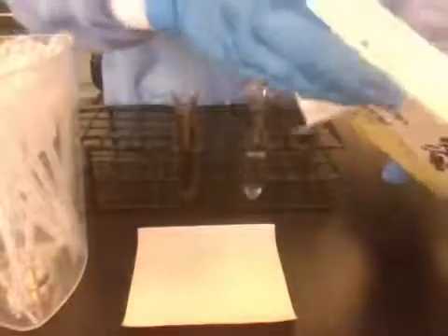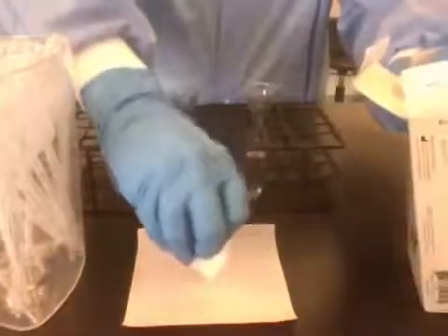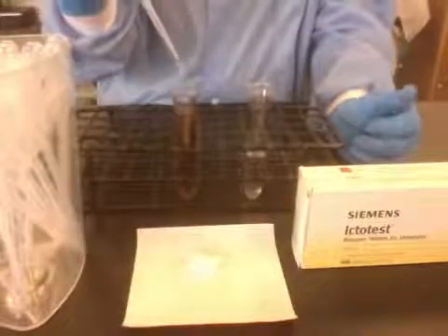I'm going to open up my kit and remove an absorbent pad. First, you're going to add 10 drops of specimen to the absorbent pad with a transfer pipette.